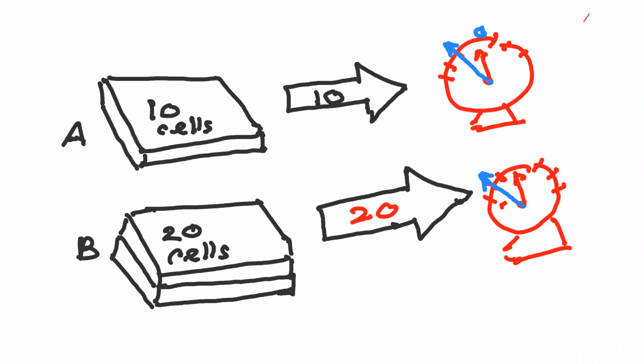That means we can measure the strength of the magnet force using the galvanometer as well. If there is a high value on the galvanometer, that means what? Yes, a high magnet force. If there is a high magnet force, the galvanometer reading will be high. If there are few cells, we can say cells, because cells are creating the force, right?